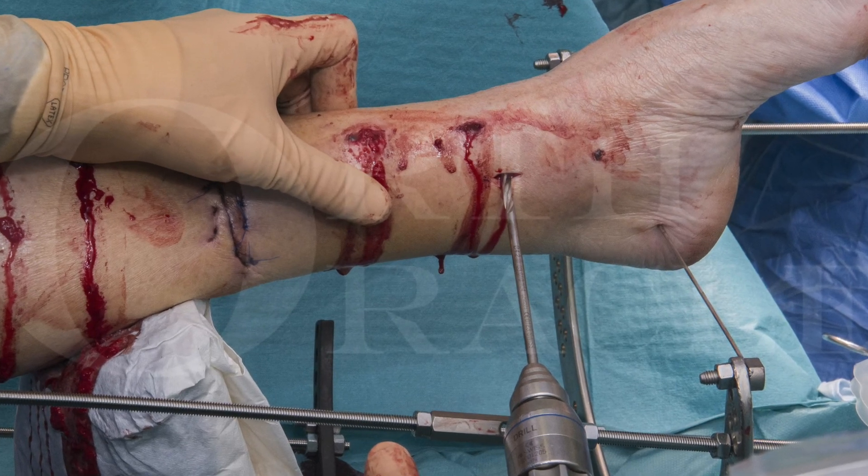The final part of the procedure is to lock the nail. For distal tibial fractures I would aim to place three screws in at least two planes. For a slick insertion, use the knife then drill, and have the depth gauge to hand before the drill is removed to avoid losing the drill hole. The depth gauge also makes a good soft tissue retractor as the screw is inserted. One doesn't always need to replace the blocking wire with a blocking screw if good fixation in multiple planes is achieved with the locking bolts, but do consider replacing the wire with a screw if there is metaphyseal comminution or poor bone quality.